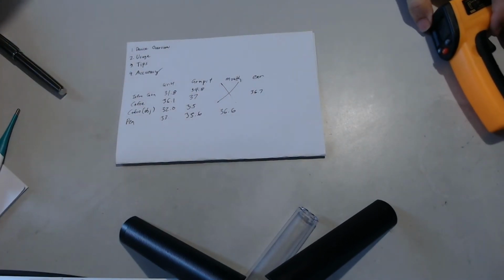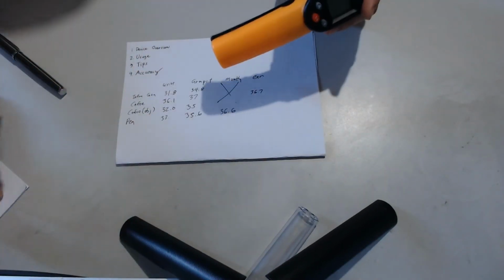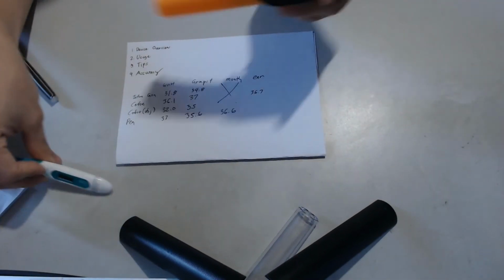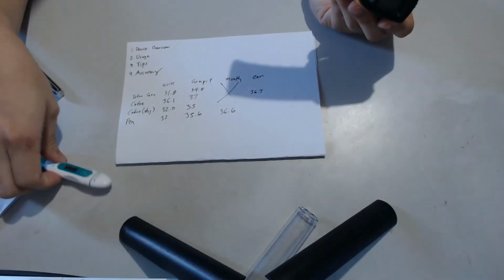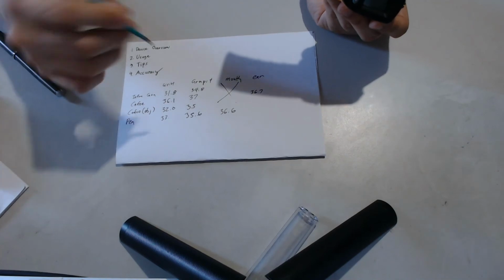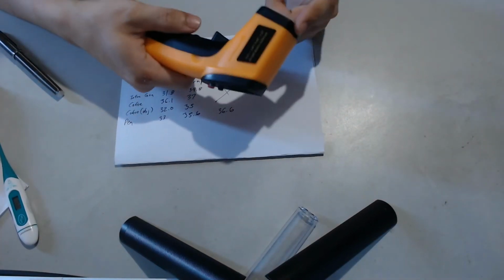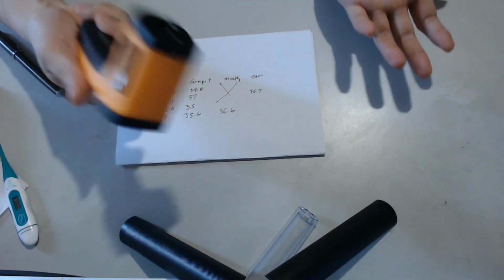Like, do not compare the temperature of this to the temperature of this, because you're measuring your skin. This one is meant for measuring your internal temperature, mouth, maybe armpit, and plus you adjust it. But this one, it's not that it's inaccurate. It's that it measures the temperature of your skin.